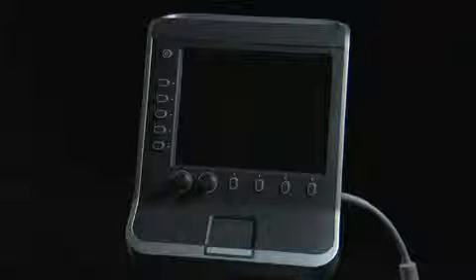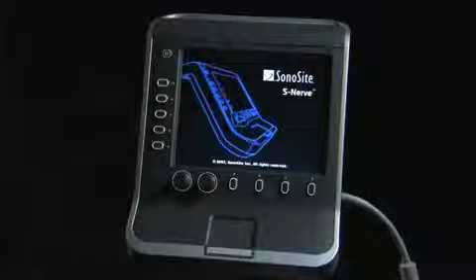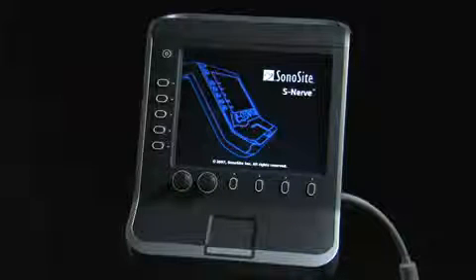Connect the power cord to the system to use AC power. To turn the system on, press the power key. The system will power up completely for use in 15 seconds.